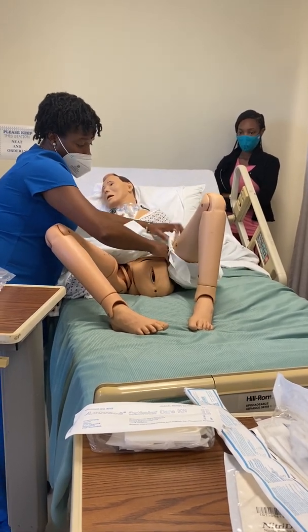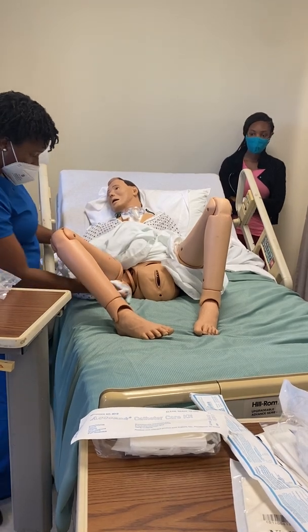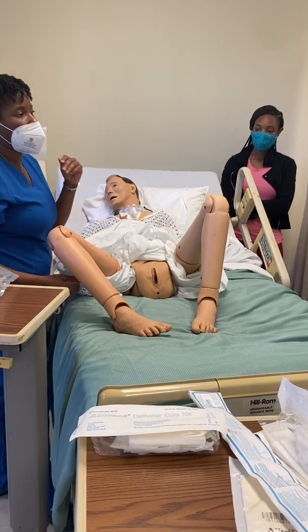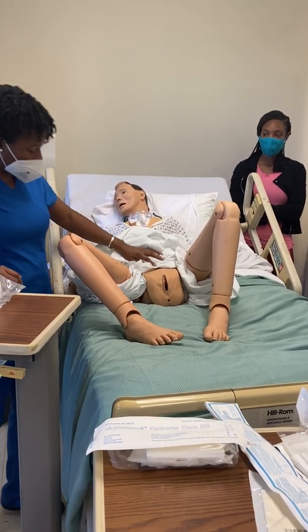Now, when I was in nursing school, we had to do all these. But that's not necessarily the case anymore. Like I said, I'm gonna talk with the team and see what they want. You see how that's flapping? That's why I don't really agree with that. But we'll see what the team says, okay?